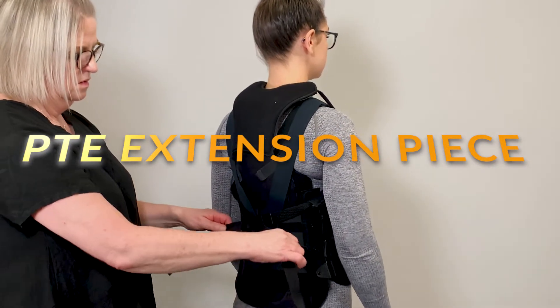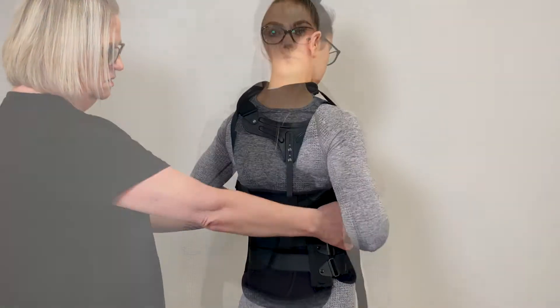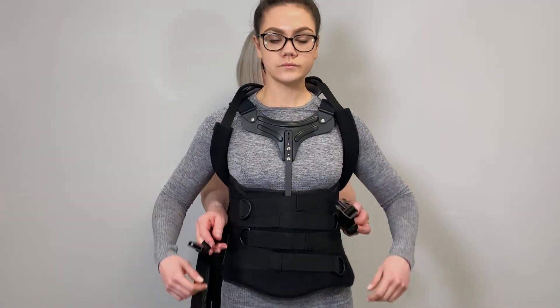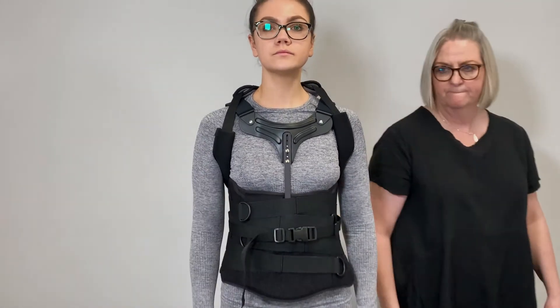If the brace requires a PTE, bring the padded straps over the patient's shoulders and back under the arms. Cross the straps behind the back and bring them around the front of the brace and secure with the buckle.